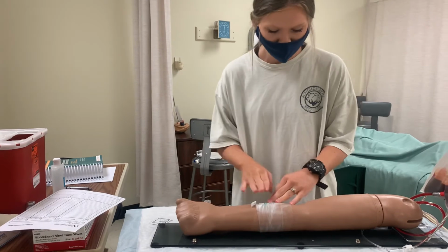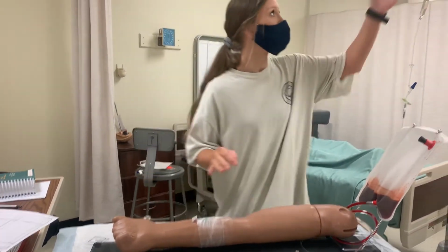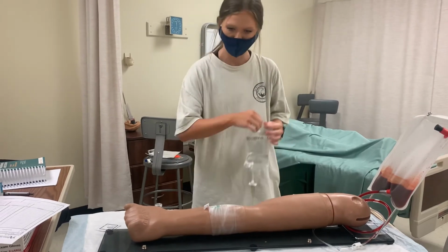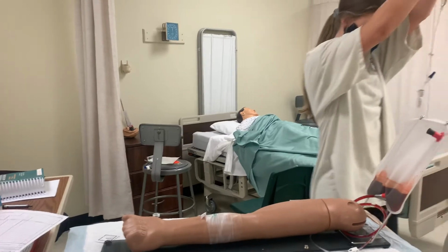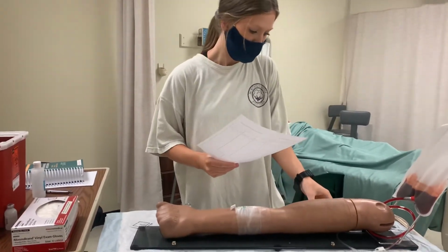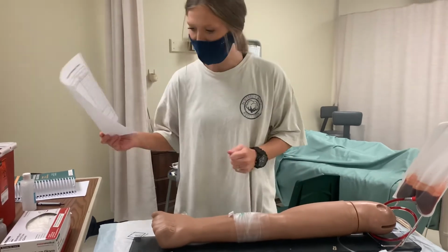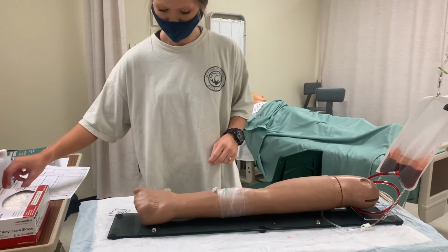I'm going to check your IV out real quick before we give you some medicine. His IV is intact. We'll check for blood return. So he has good blood return, so his IV is working well. Alright, now I'm going to take one more look and compare it. Make sure I have the right medication, the right patient. John Smith, furosemide 20 milligrams. Okay, so it matches my MAR. Now I'm going to administer it.